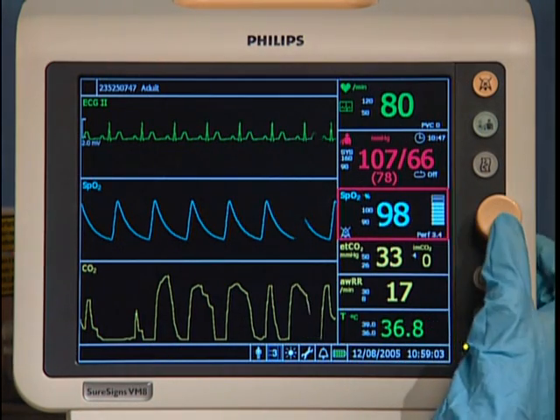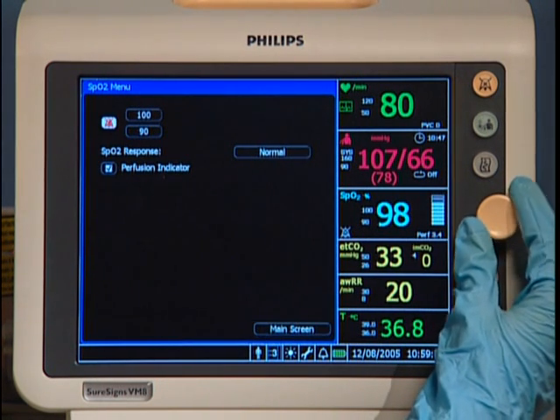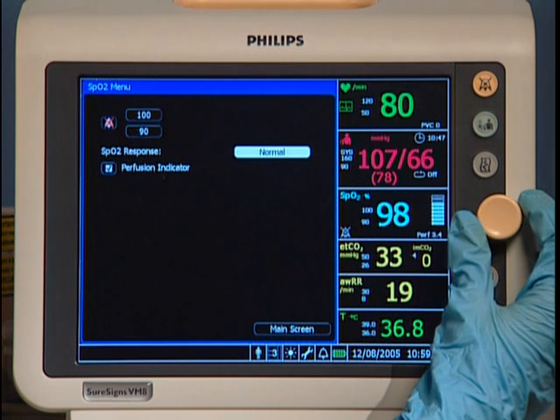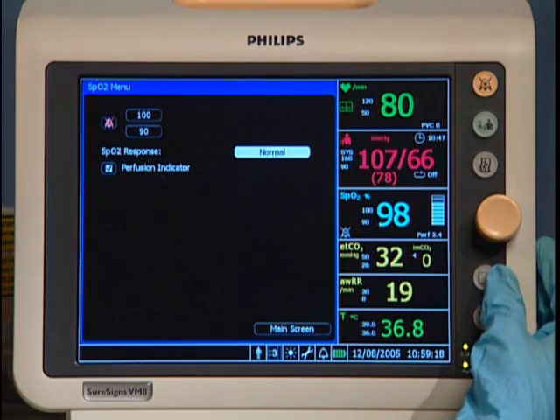Just highlight the pane you want to change, press the navigation wheel, make the changes in the open menu, and then press the main screen button to close the menu.